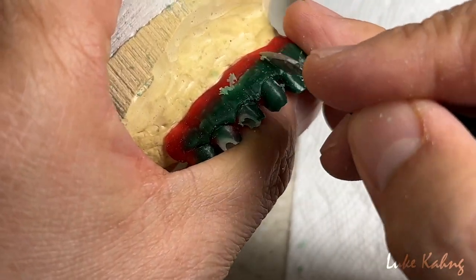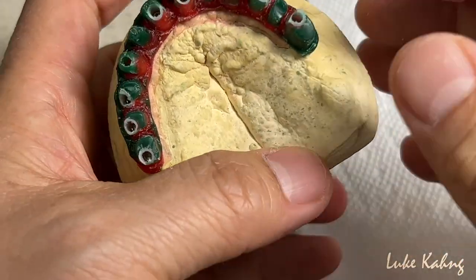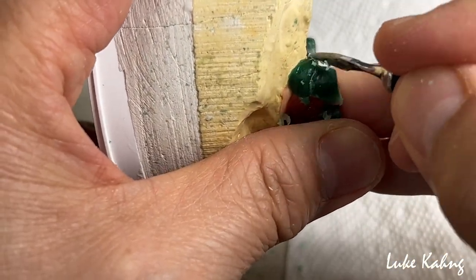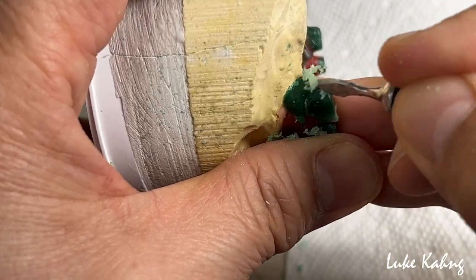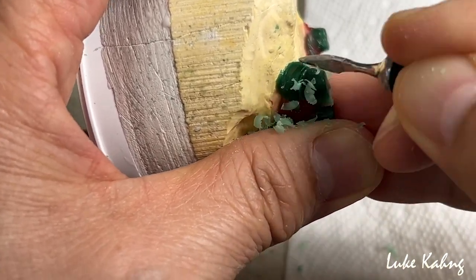Make nice facial contours. You can cut it here — I don't need this much in certain areas. Because this is not the aesthetic or functional zone, so we don't need this much. I'm trying to grind and refine the shape.